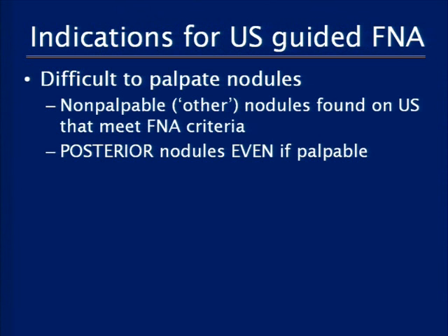So every nodule that you have in your thyroid does not need to be biopsied with ultrasound guidance. We generally do most of our biopsies today with ultrasound guidance, but it's not an absolute thing that has to be done. There is still a role for biopsies with palpation. But there are certain nodules which absolutely should never be biopsied by palpation because you have a higher chance of not getting a good result or a false result.